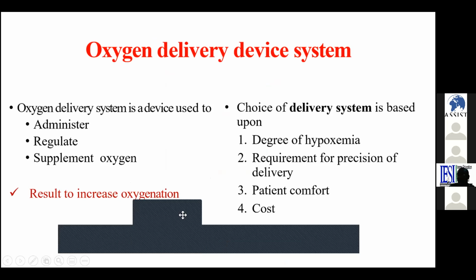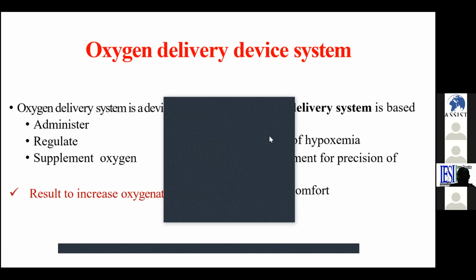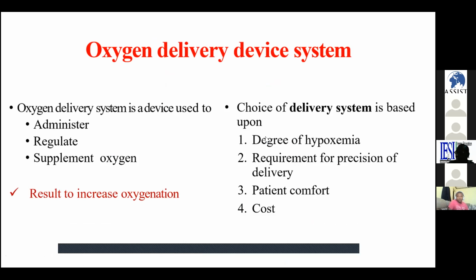Okay, so let's talk about oxygen delivery device. So when we say oxygen delivery device, we want to say equipment which are used to administer oxygen to the patient.